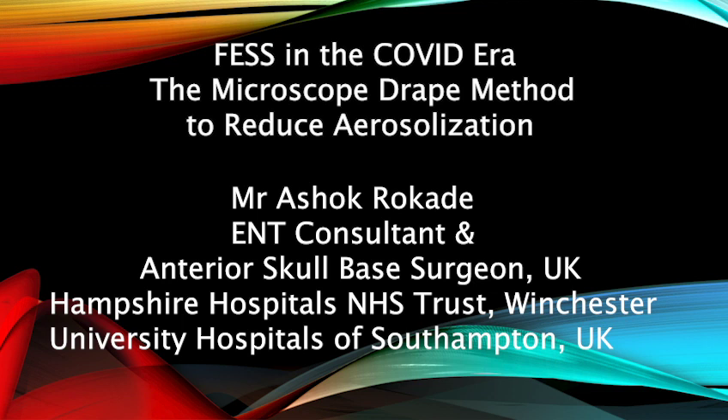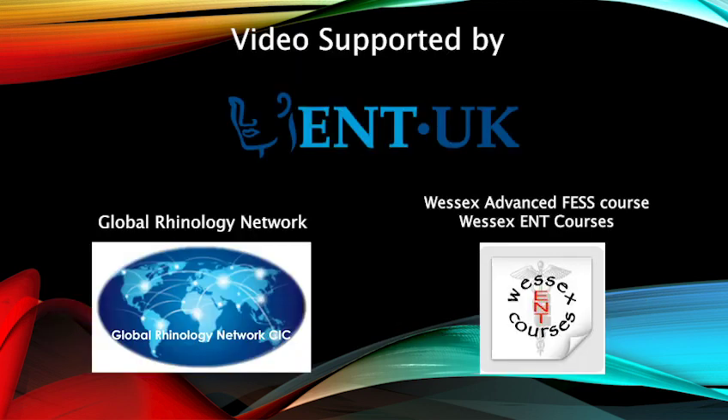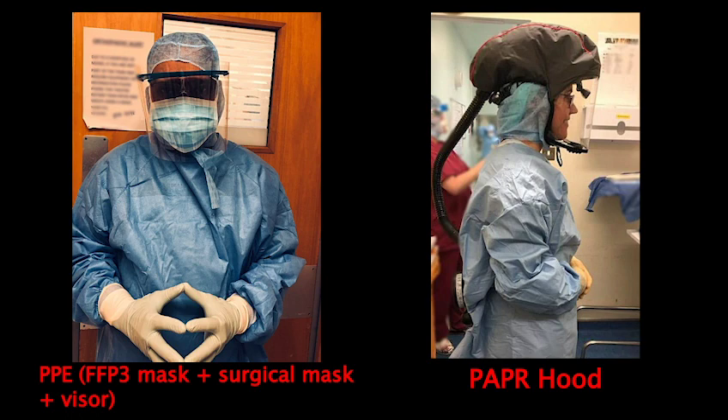We described the procedure of creating a surgical tent in a step-by-step manner in the following video in a simulated setting. Please note that the theatre team is not wearing the correct level of PPE. It is mandatory to wear appropriate PPE for surgeons and the rest of the team.